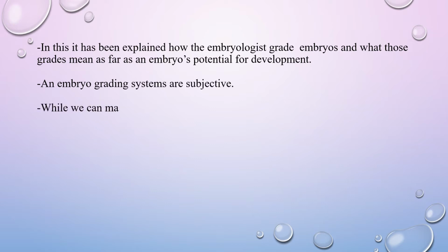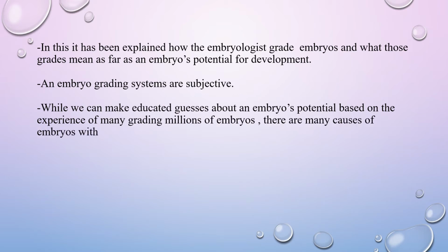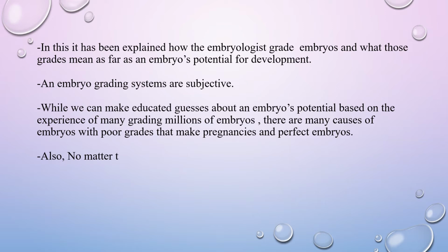While we can make educated guesses about an embryo's potential based on the experience of grading millions of embryos, there are many cases of embryos with poor grades that make pregnancies, and perfect embryos that do not. Also, no matter the grading system, the embryo grades do not tell what is going on inside the embryo genetically.